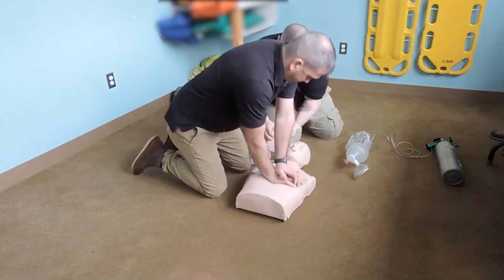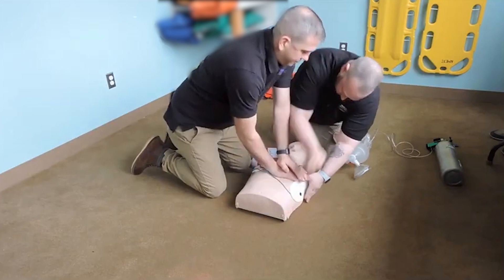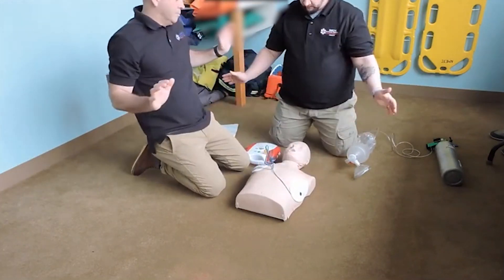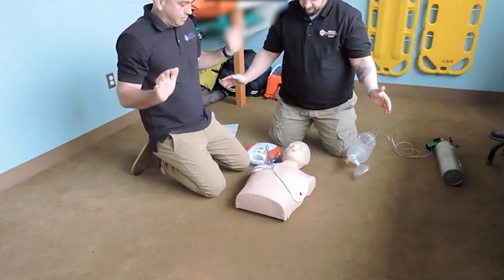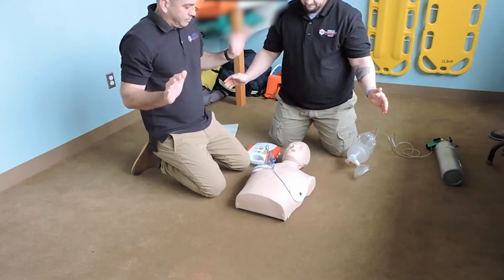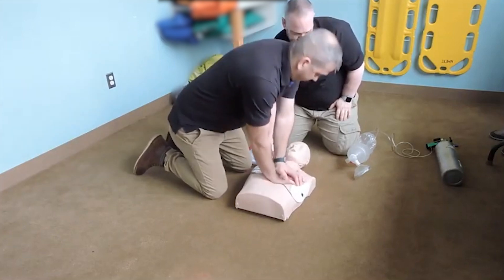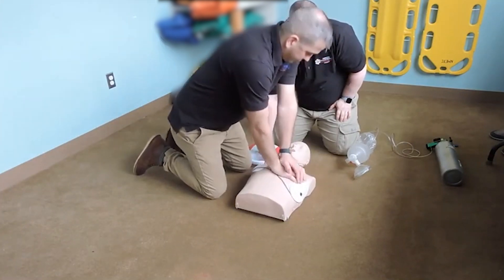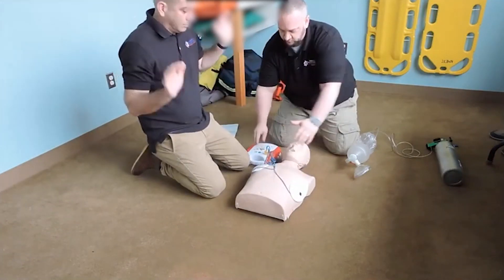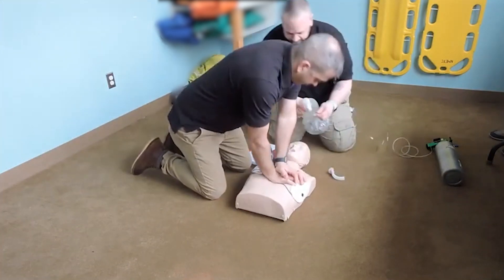Properly placing the pads. Analyzing rhythm — clear the patient while we analyze. Everyone stands clear. Shock advised. Delivering shock, resuming compressions. Now I'm going to size and insert my OPA. Does my patient accept? He does.